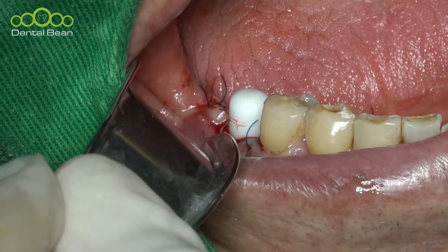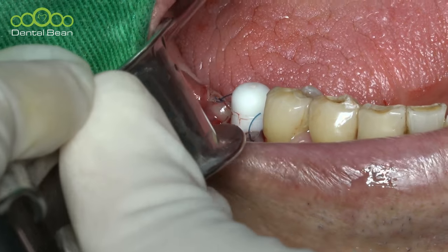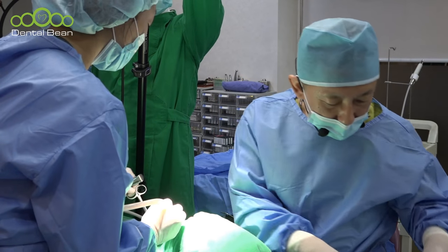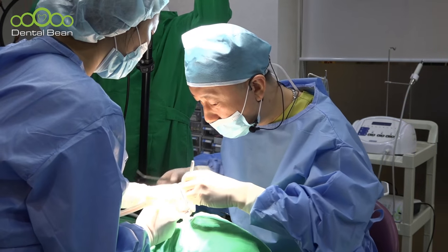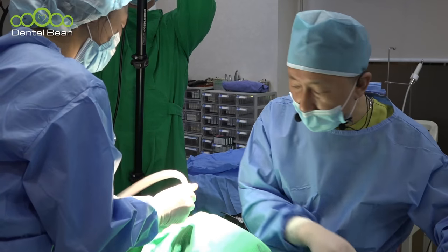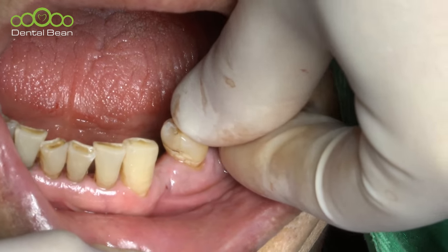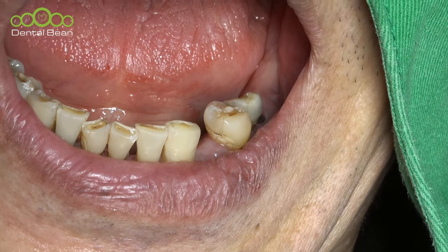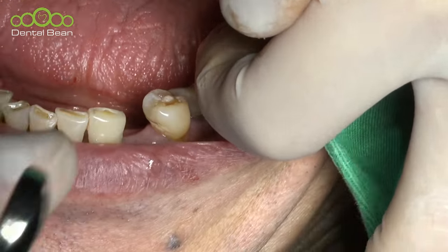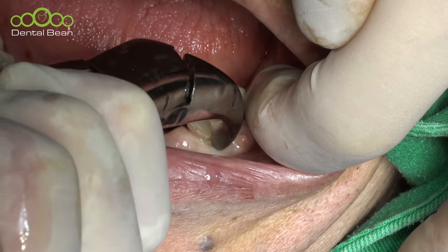Okay, today final area, lower left side. Okay, now turn your head slightly to the right. I think this area has a big apical lesion. So at this time, extraction first. Tooth forceps. Forceps. This area also. This is almost a floating tooth.